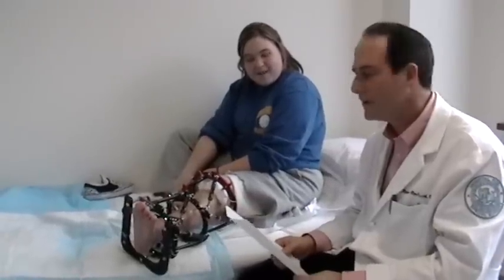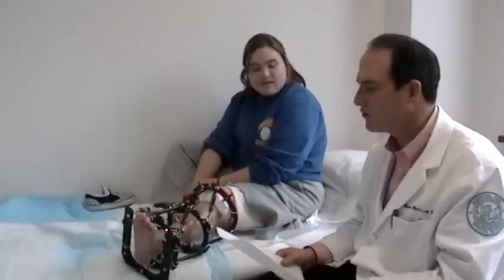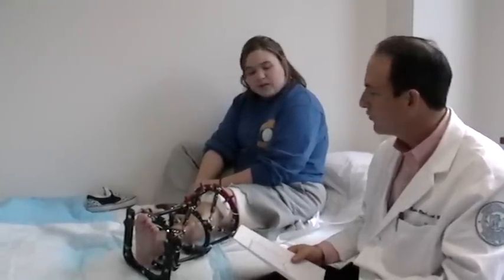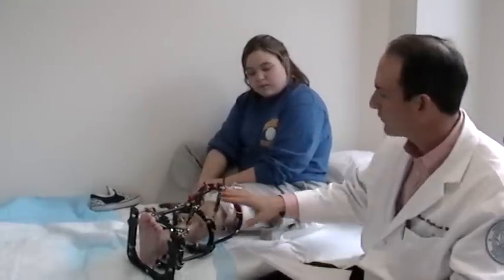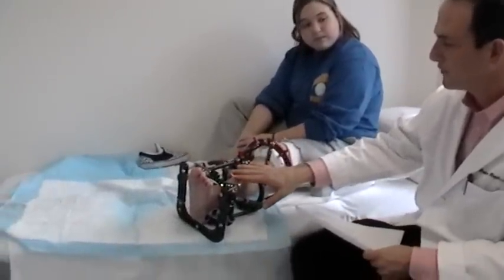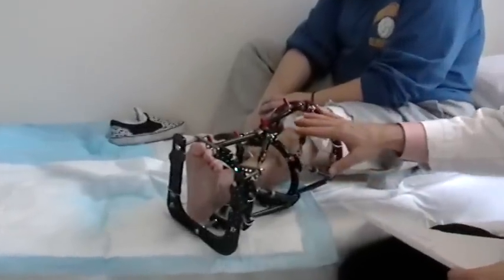Hi, I'm Dr. Rosbrook, and I'm here with Caitlin. We're going to demonstrate how to make adjustments of a Taylor Spatial Frame. Caitlin's frame has two different levels of TSF struts, and there's a different schedule for each level.